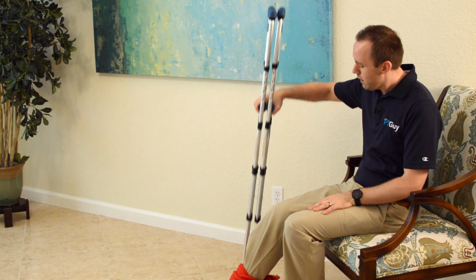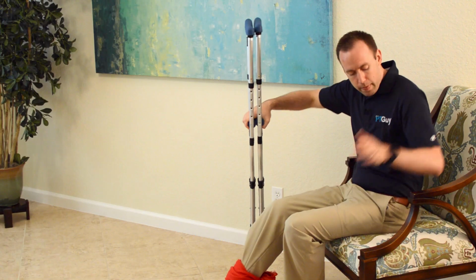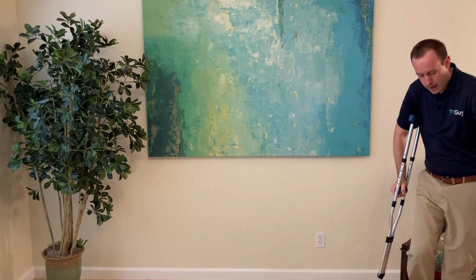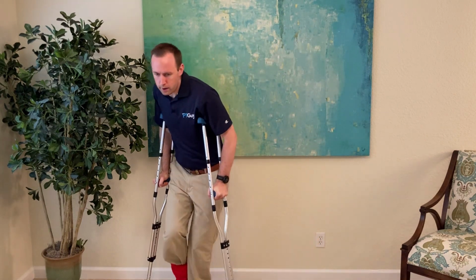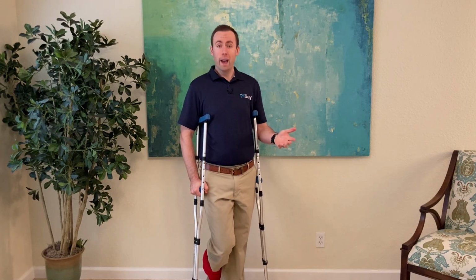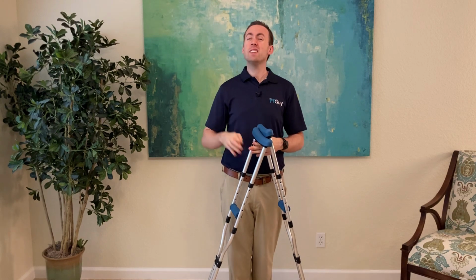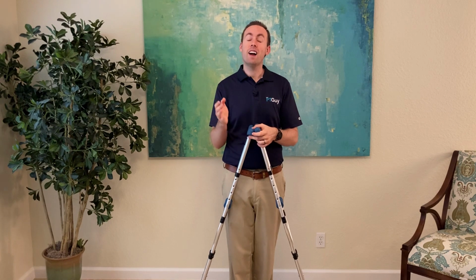When you get up, it's going to be the same thing. You take your crutches off of the floor or from the wall, you put them down like this, you grab like this, you have one hand here, you stand up, your leg didn't touch the ground, and then from here, this is the tricky part about crutches, hold on to one, take the other one, and bring it out, and you're on your way, okay? So that's a way to walk around safely using the crutches if you can't bear any weight at all through that foot. So whether you can put no weight through that leg or even just a little bit of weight, either way, now you know how to walk safely using crutches and not end up falling.